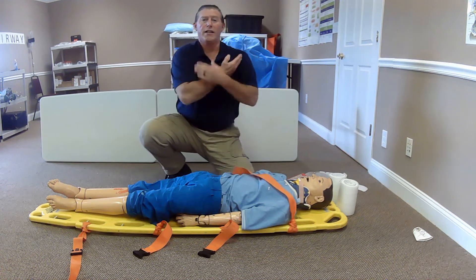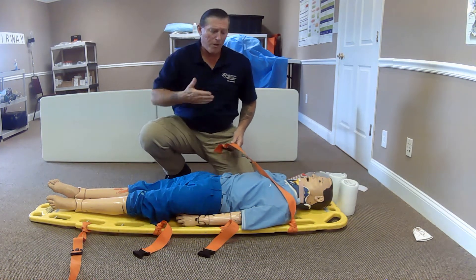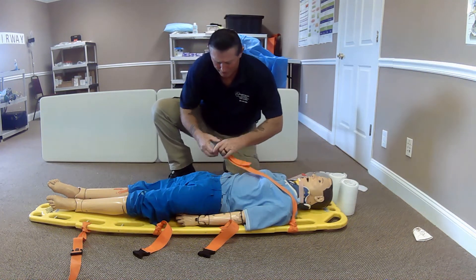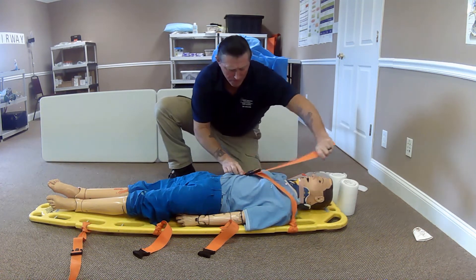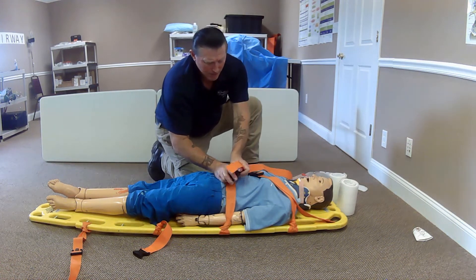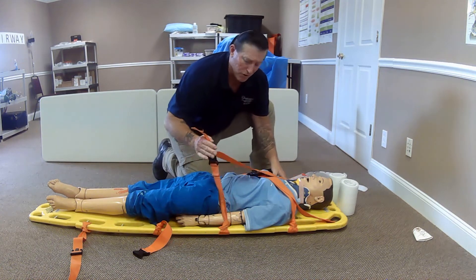In a crossing pattern, I like to do the torso this way. Instead of just a single strap, we like to go two across, kind of like a four-point cross. I will capture this arm as I'm coming across the torso, capturing this side as well, making sure we are over the top of the shoulder.